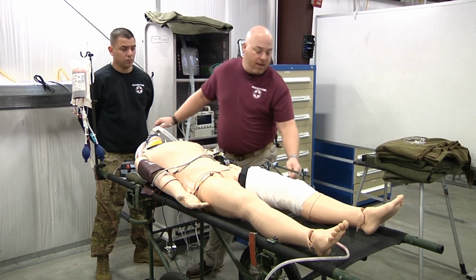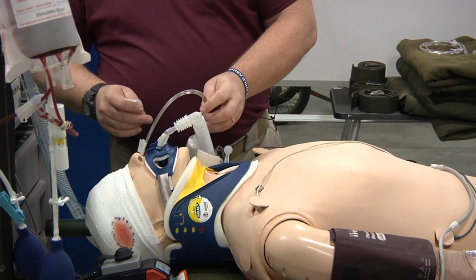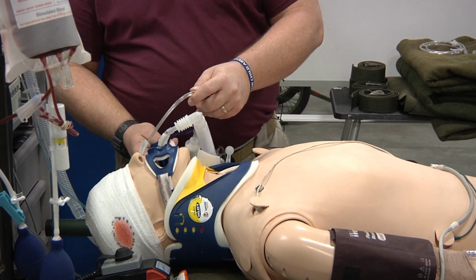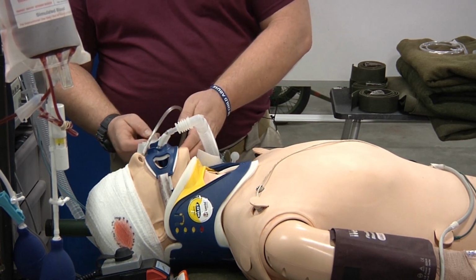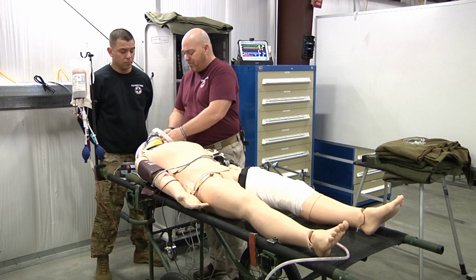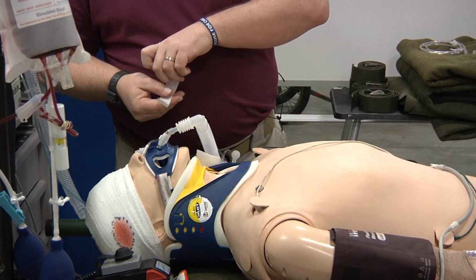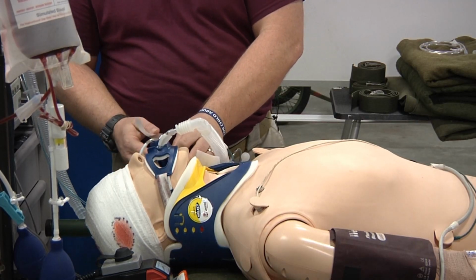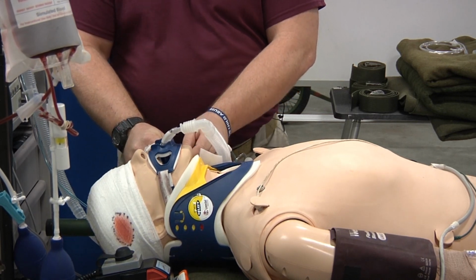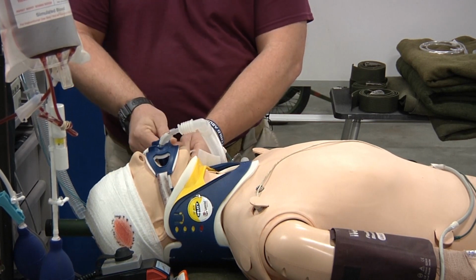All right. And then finally, what you can do is you can secure your NG-OG. And a technique to do that is you can secure it to your ET tube. You can secure it to your ET tube cuff holder, your ET holder. And that's a good technique, but I don't like to necessarily put it around the tube. I don't want anything pulling on my airway as much as possible. So if I put it around the cuff holder, the ET tube holder, I know that it's still going to stay in place.